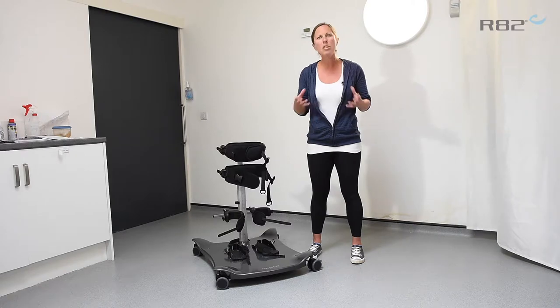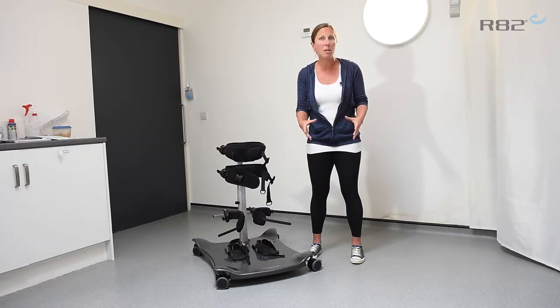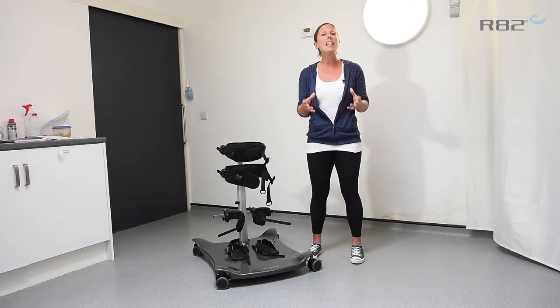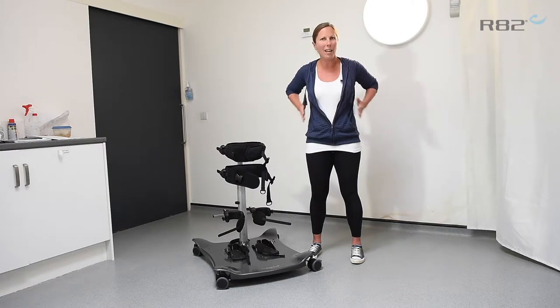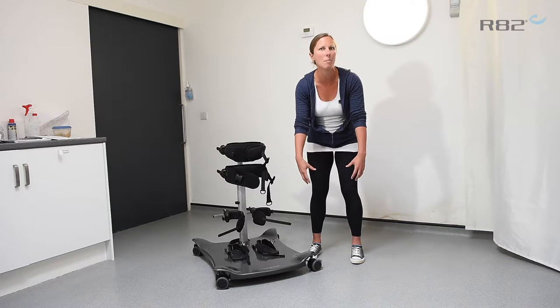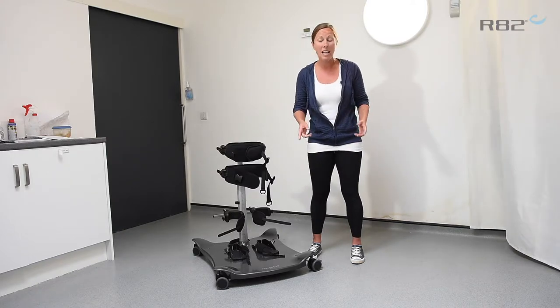When we're using our hands, we're often setting them at certain levels of support, so we know whether we need to be high around the trunk or whether we lower them slightly. But in those programmes, we often need more than me, because when I'm supporting at a level of trunk or hips, I often need somebody else to come in and support legs and hip position in order to get that correct body alignment, that static posture.